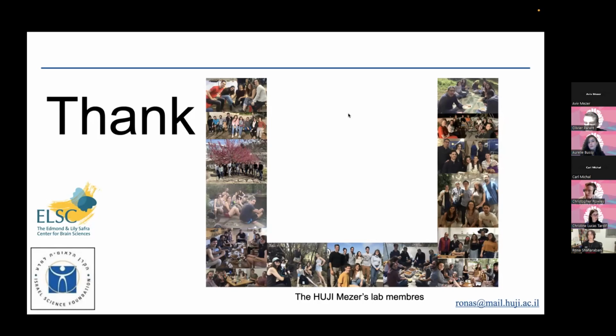No. So the multiple echo is one sequence requirement that we need for the model. The other requirement sequence is the water fraction. So it's the same MTV that Aviv mentioned before. It's a different set of measurements, not related to the echo data that we acquire. And if you would like, you can contact me by email, and I can send you the papers. Aviv already mentioned them about the MTV or water fraction mapping.